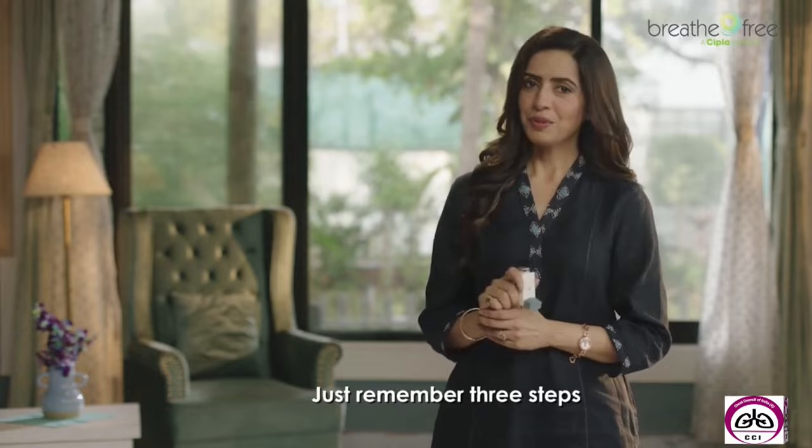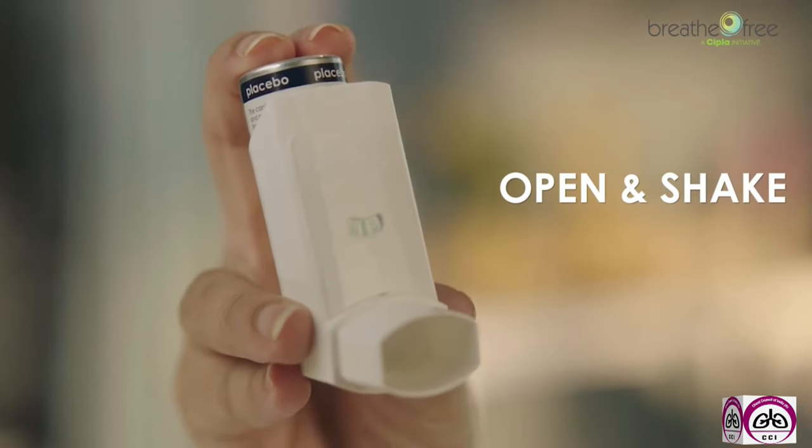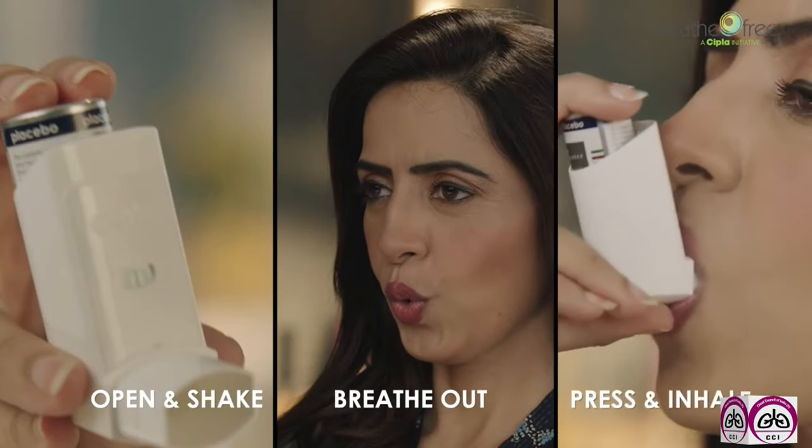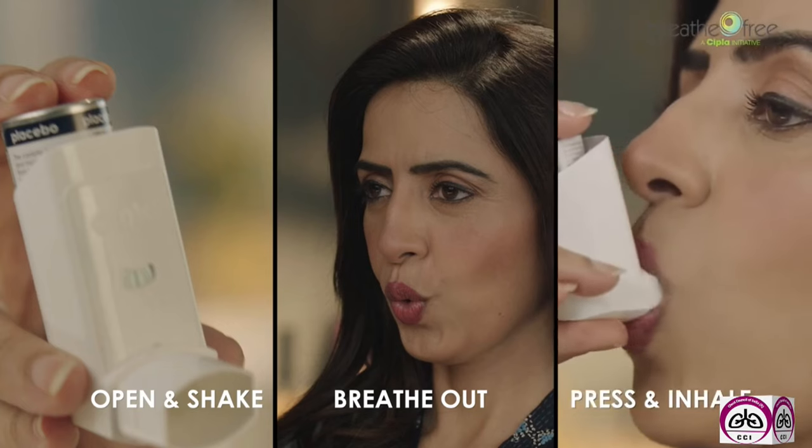Just remember three steps. Step 1, open and shake. Step 2, breathe out. Step 3, press and inhale.